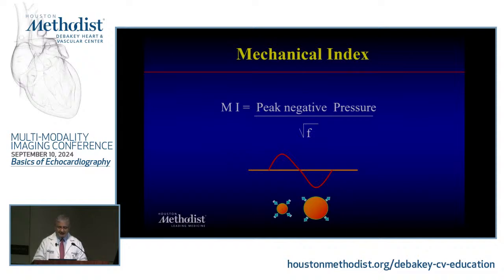because of contrast imaging. And early on, we found out that if you send a lot of energy, the output is very high to these very fragile bubbles, and the bubbles could be filled with air or inert gas. They could have a different shell, etc. We'll have another talk about contrast.